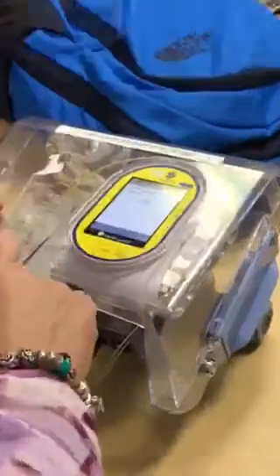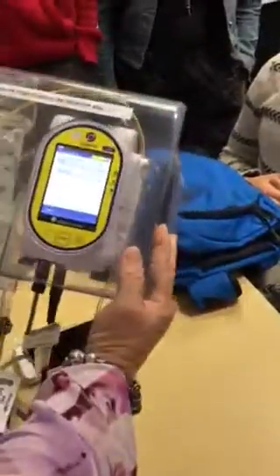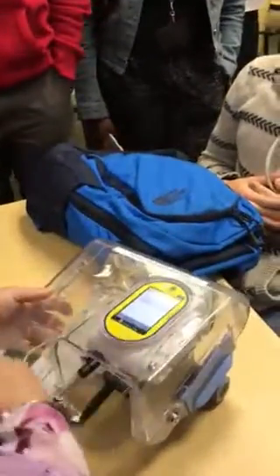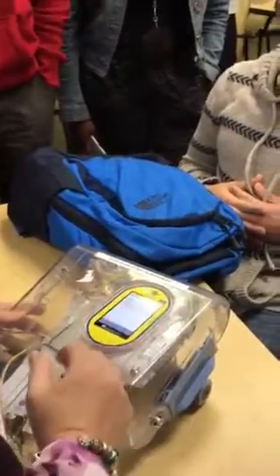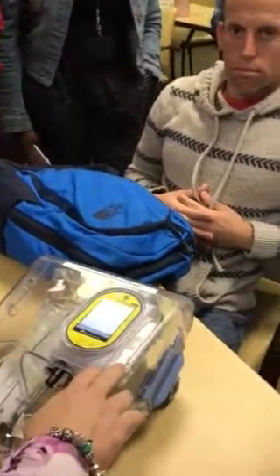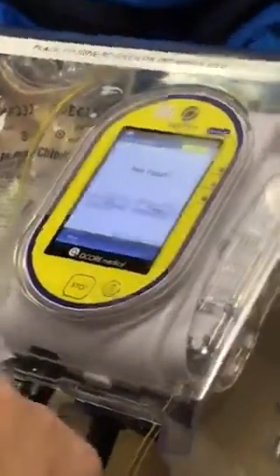And if I change here, you can see the selections that I get to choose from: L&D, post-op. Can you see that? So for OB, we're going to choose L&D. It says it up there. And we're going to pick new infusion. Is it a new patient?